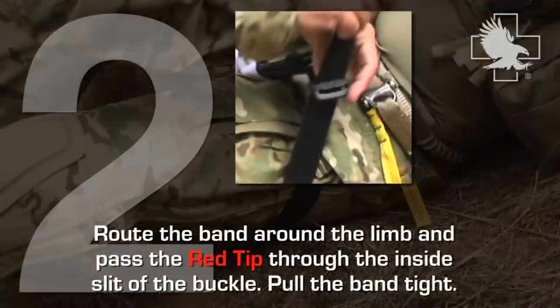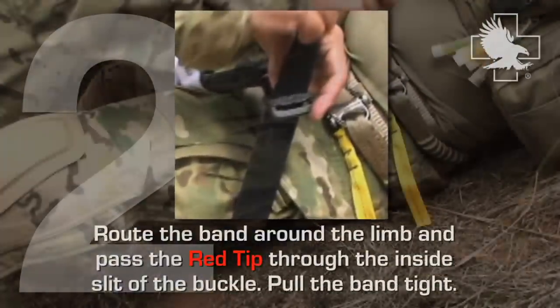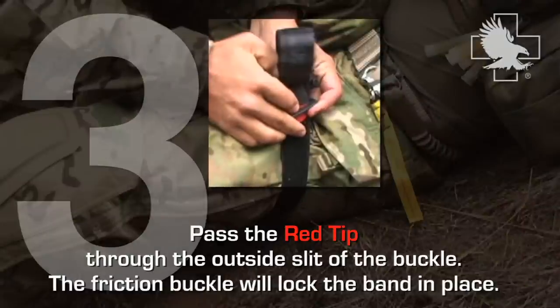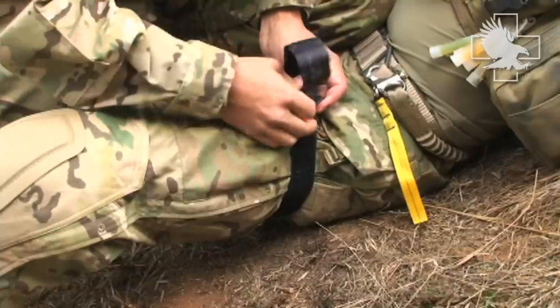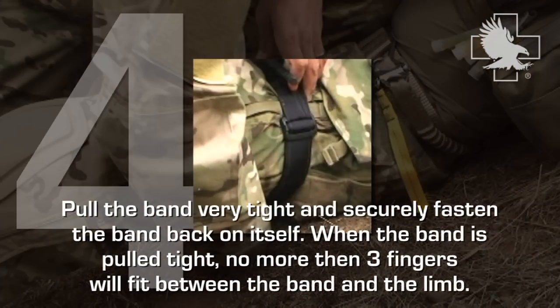Route the band around the limb and pass the red tip through the inside slit of the buckle. Pull the band tight. Pass the red tip through the outside slit of the buckle — the friction buckle will lock in place. Pull the band very tight and securely fasten the band back on itself.